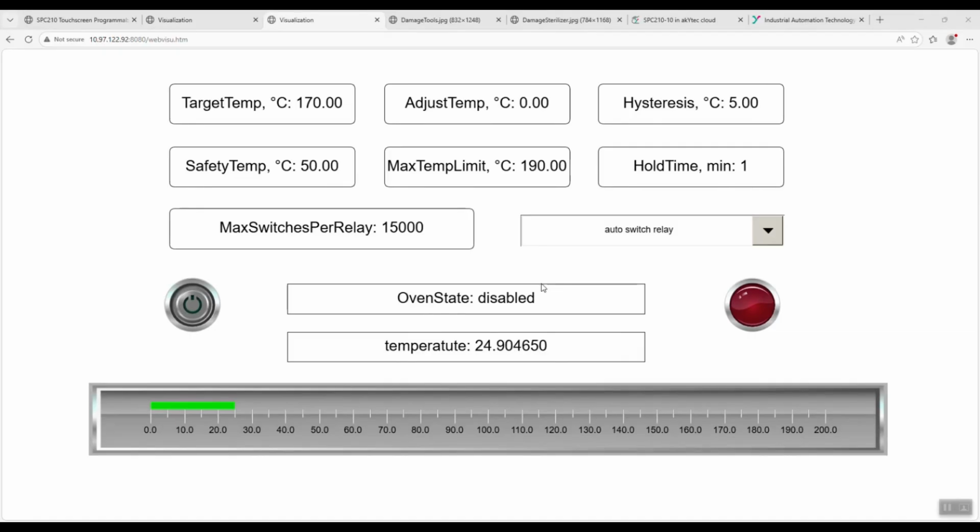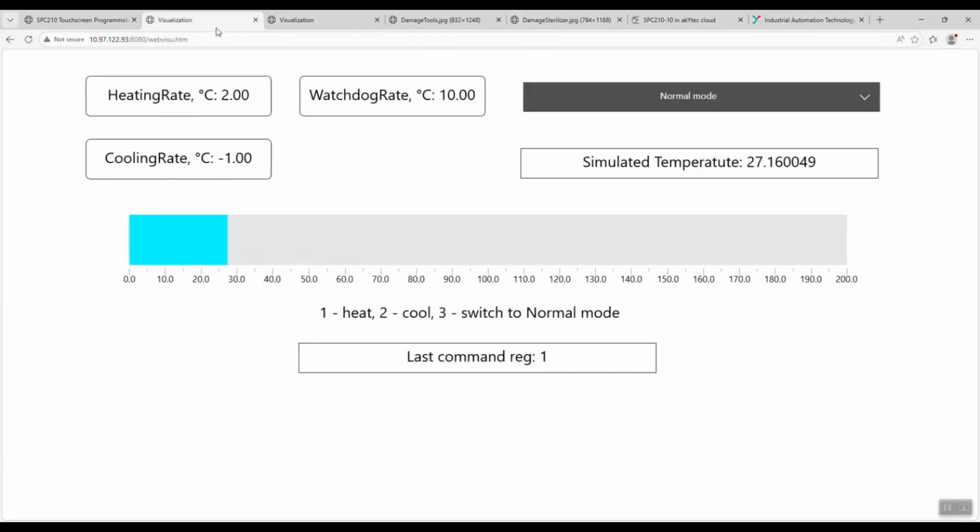Now, let's switch to the visualization of our main project. Press the power button and watch the temperature change process in the emulator. As you can see, the emulator changes the temperature according to the specified settings. Let me know in the comments what other settings you would add to the emulator project, because it's obvious that a sterilizer has characteristics like heater power, tank volume, and thermal insulation. And depending on the sterilizer model, all the characteristics I mentioned can be completely different.